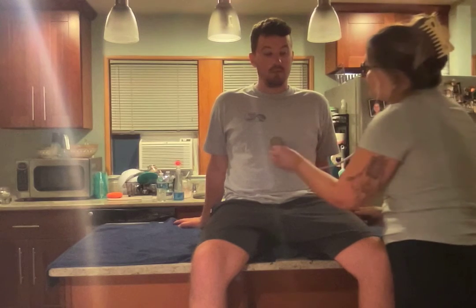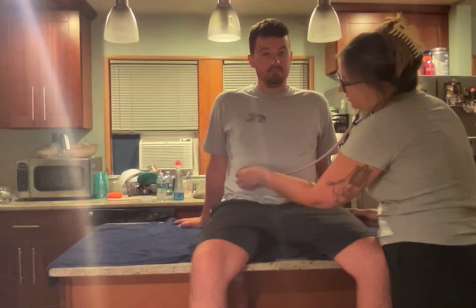Good. Good bowel sounds. Okay. So then with the bell of my stethoscope, I'm going to listen to your major arteries, okay? So I'm going to listen to your aorta. Good. I'm going to listen to your renal. Good. I'm going to listen to your iliac. Good. And then I would listen to the femoral down here.